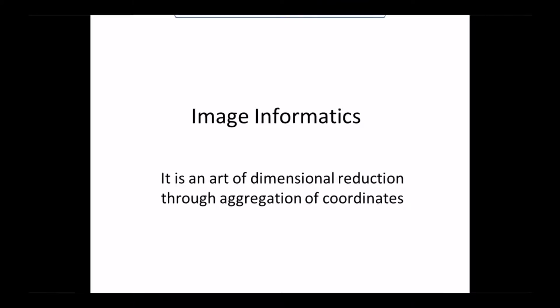And if in plane they're 1 millimeter, then you would have maybe 200,000 total voxels that would make up all the light board images. We're at 1 millimeter resolution, and they've adopted the research protocols. So for a standard T1 image, you now have 1 million to 3 million voxels of information. You'd have to put 300 sheets up on the light board, and you'd have to look at every millimeter section.